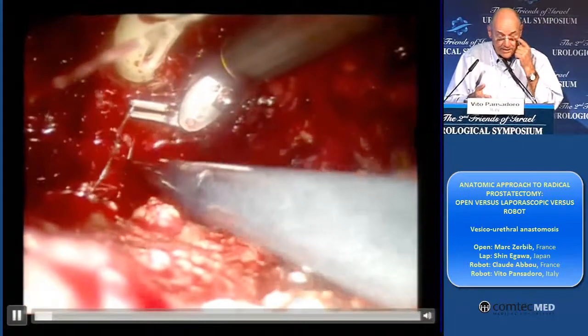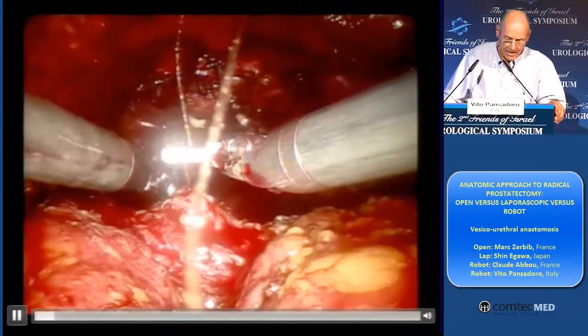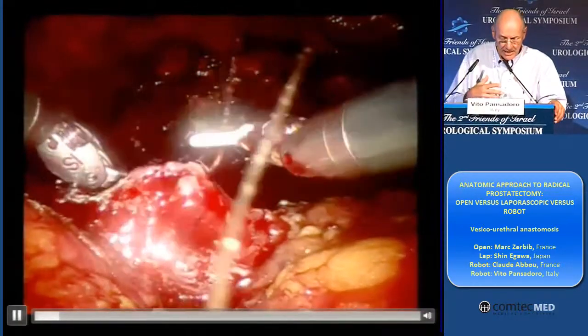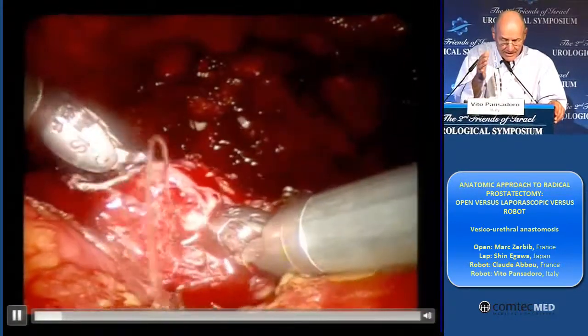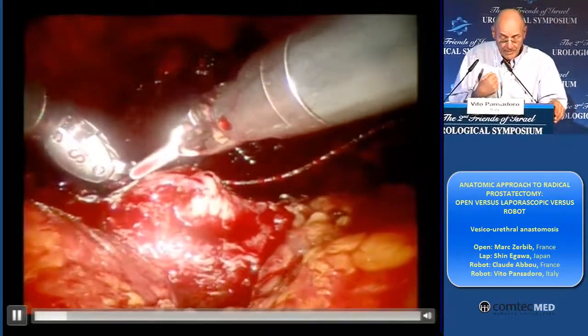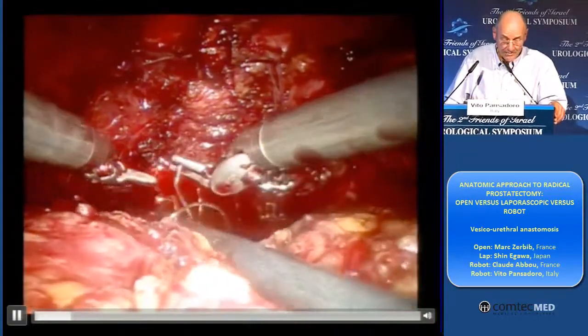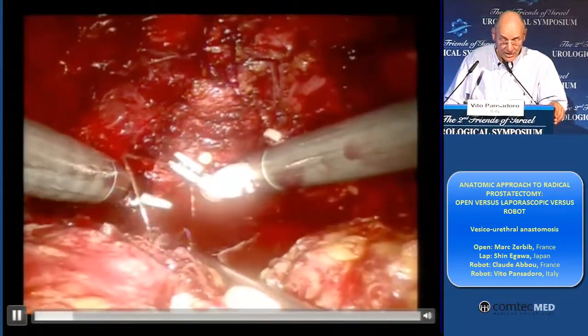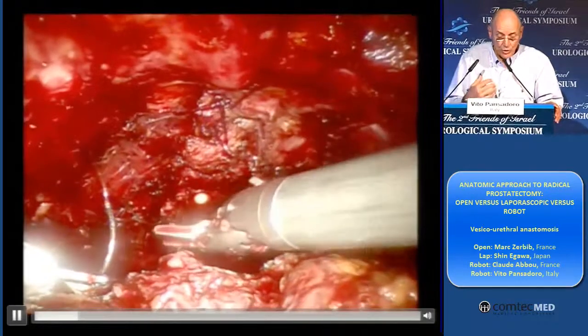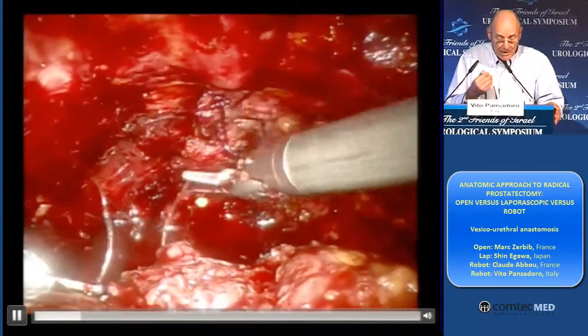So I don't have the Denonvillier fascia. But I do connect the distal stump of the Denonvillier fascia to the posterior face of the bladder. And so the advantage is to connect all the structures in the pelvis, but also to bring the bladder down.